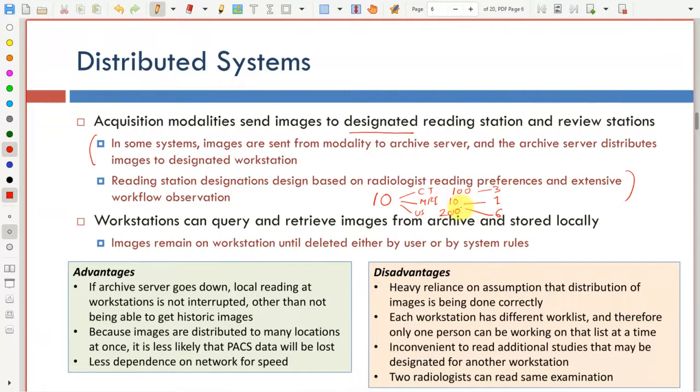And it's not enough to have the number of cases. Sometimes for CT cases, for example, the time to do the diagnosis is much longer than ultrasound. So if you have 100 cases here, they might take maybe 300 man hours. Here, for 200 cases, you're probably going to take half an hour to diagnose each one, so it's like 100 man hours. So here you need more workstations, because the doctors will be spending more time here.